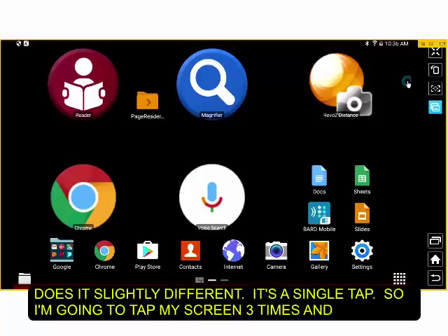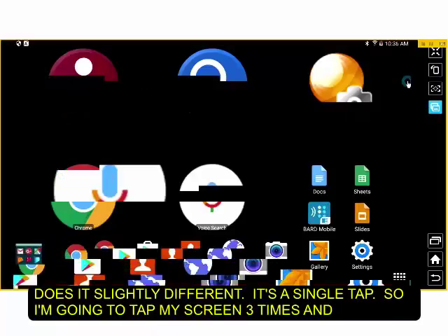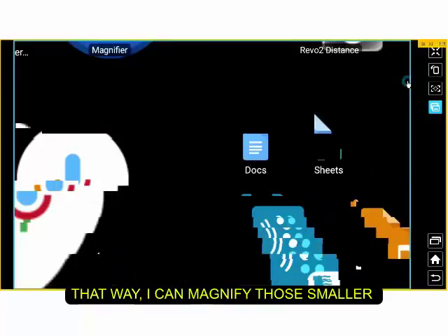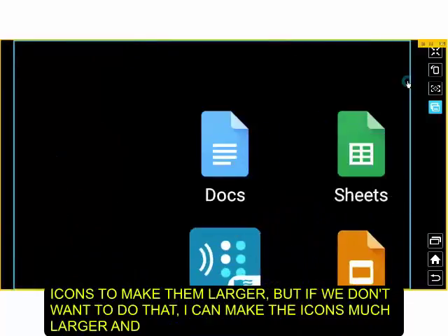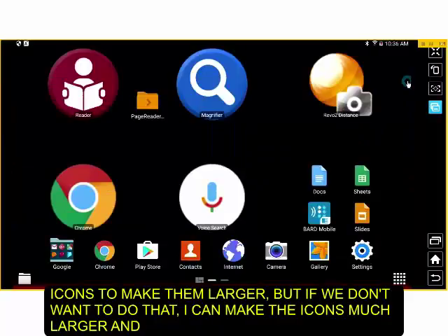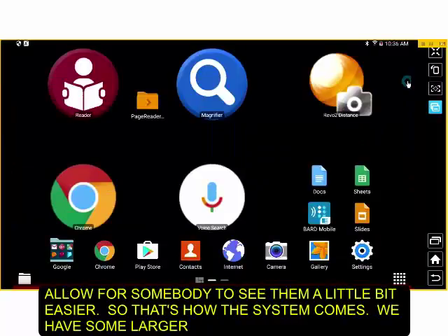Android does it slightly different. It's a single finger triple tap to allow for magnification. So that's what I'm going to do, I'm going to touch my screen 3 times. And that way I can magnify those smaller icons to make them larger. But if I don't want to do that, I can actually make the icons much larger and allow for somebody to be able to see them a little bit easier. So that's how the system comes.